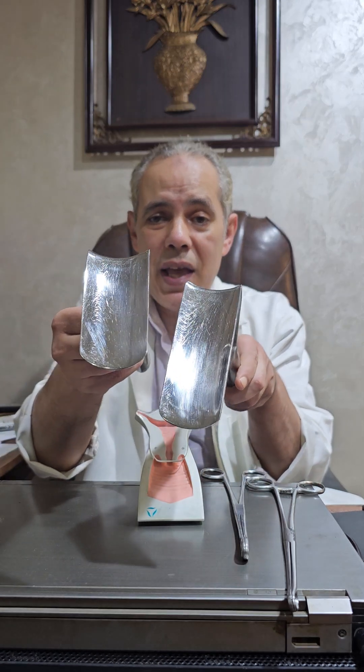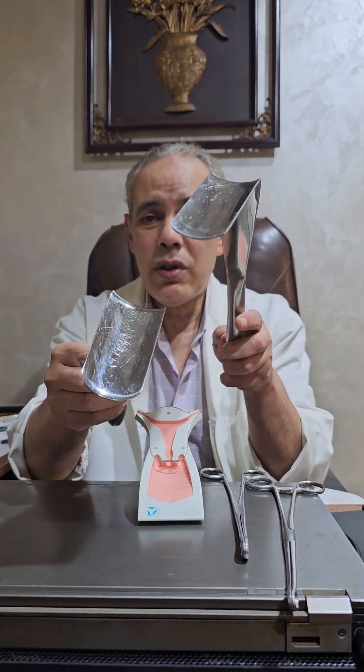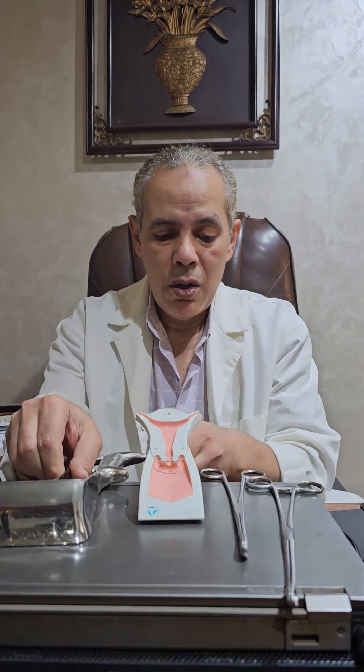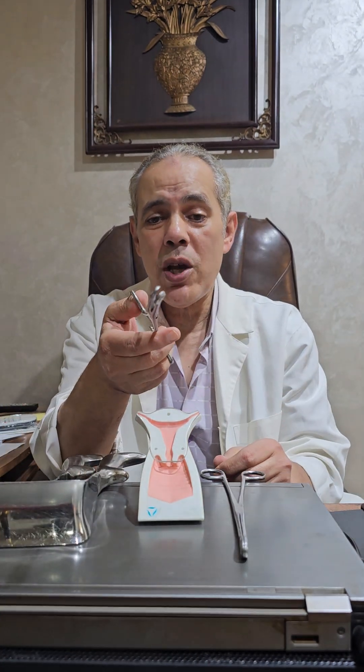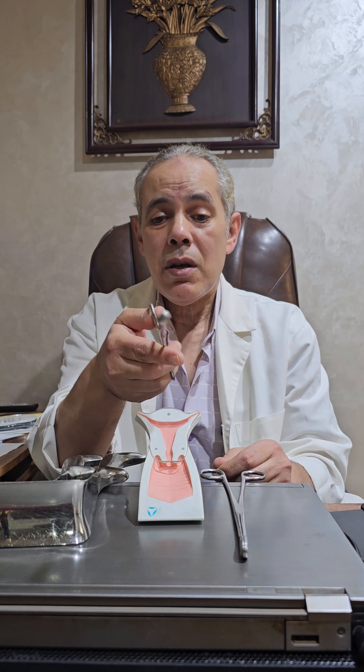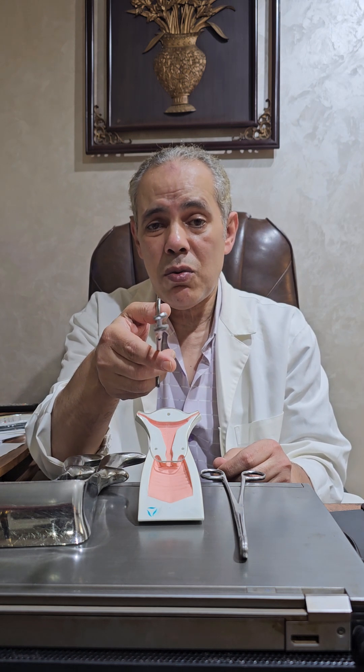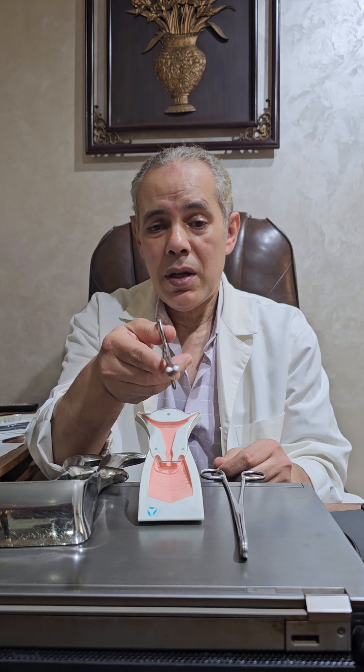The instruments needed: a vaginal retractor — right angle, like this one — for retraction of the anterior and posterior vaginal wall. Two ring forceps, straight or foister forceps, to apply on the anterior and posterior lip of the cervix to do traction on them, like this one.